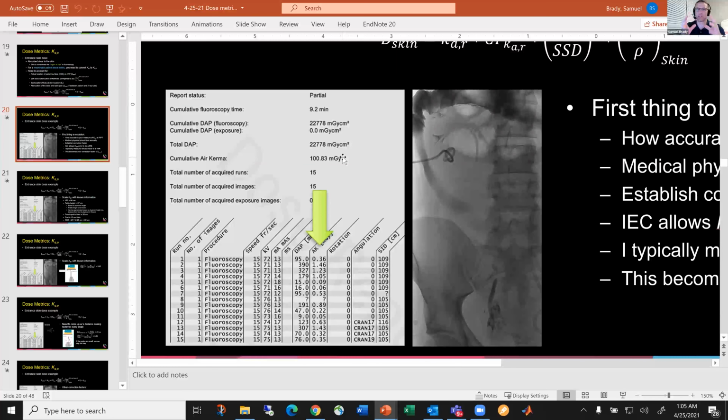And there is a lot of information. If you're comfortable looking at the DICOM information, you open up the image and look at the DICOM information, and it will tell you everything. It'll usually tell you angles, dosing, and dose per angle. If you've ever looked at a structured dose report, a DICOM report for a fluoro, it is hundreds of pages long.